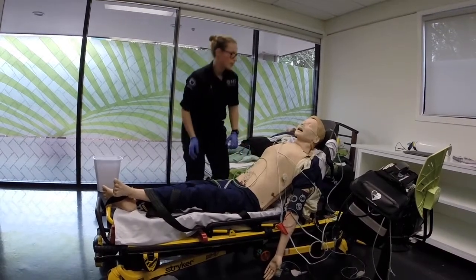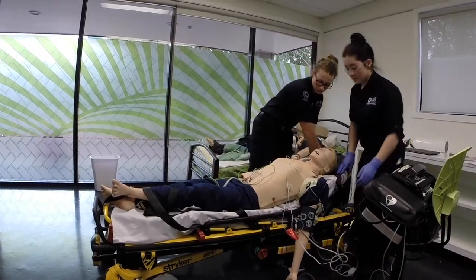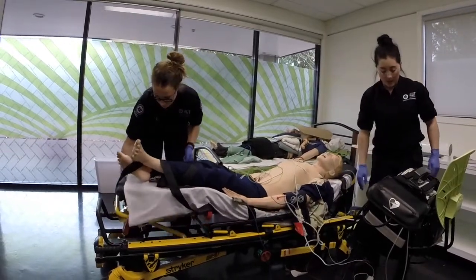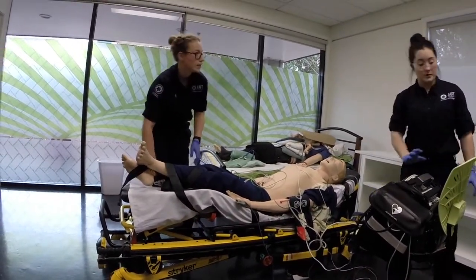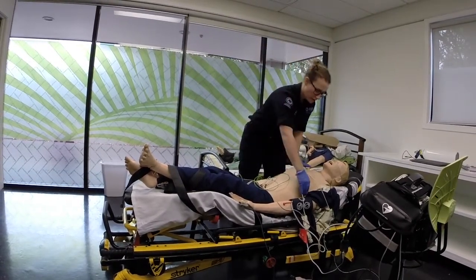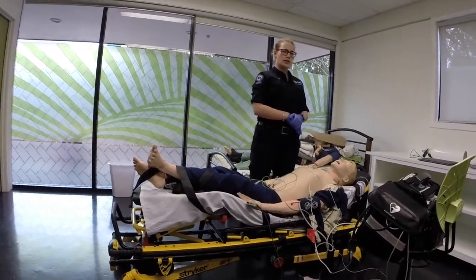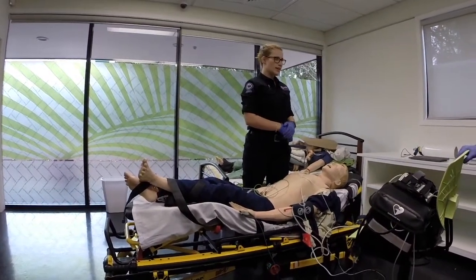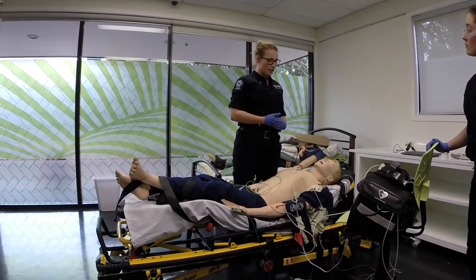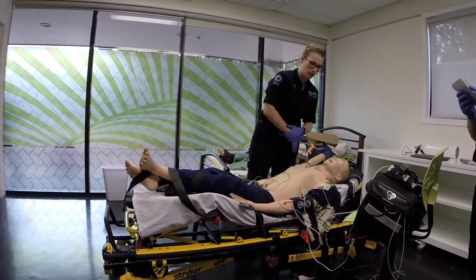We'll also start lying him supine. So what we want to do now, Bob, not all the way, just about there, and raise his legs. So he's actually at 98 now. Heart rate's still 170. Okay. So Bob, what we want to do is just electrically give your heart a shock. Is that pain gone down? Oh, maybe a little bit. It's still sore though. Okay. Yeah, so I can give you a little bit more fentanyl, but we want to just electrically shock your heart in the hopes that it'll come back into a normal rhythm. Does that sound good? Yeah, that sounds good.